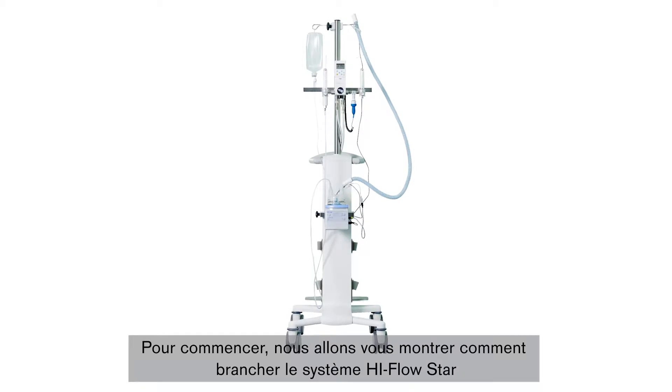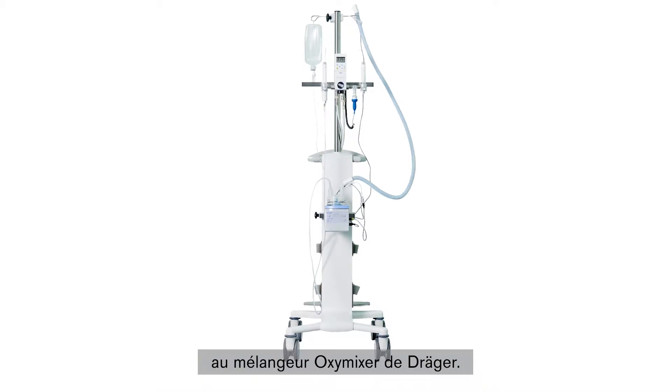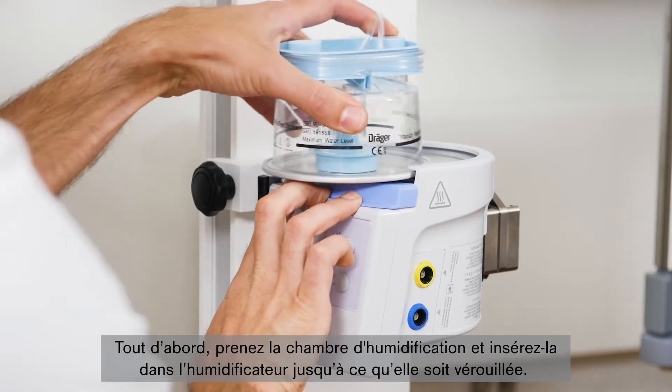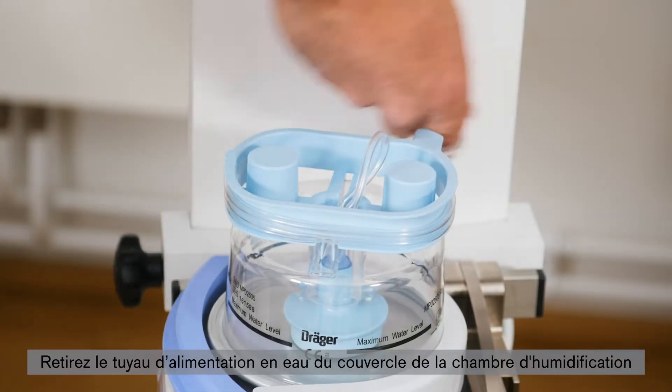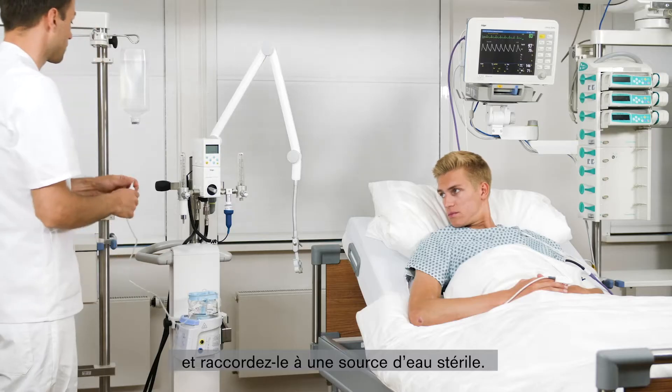The embedded heating wire helps ensure even heat distribution, which provides optimally climatized air for patients and prevents condensation. We will now show you a step-by-step guide to attaching the High-Flow STAR system to the OxyMixer blender from the Draeger portfolio. First, take the water chamber and push it into the humidifier until it clicks into place. Then take the water supply from the mounting on the water chamber and connect it to a sterile water source.